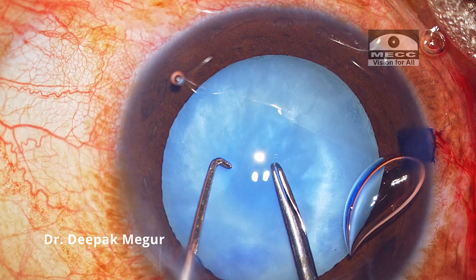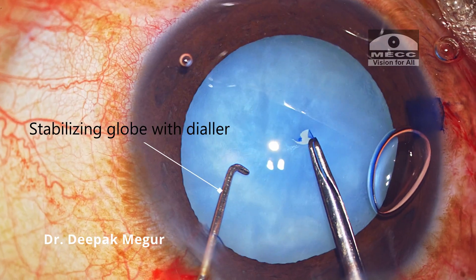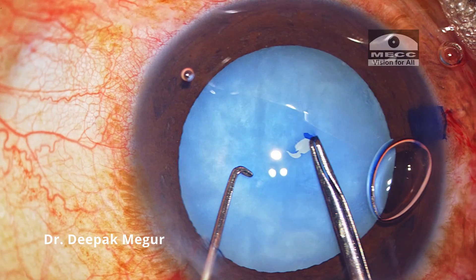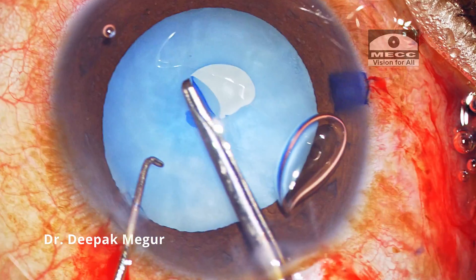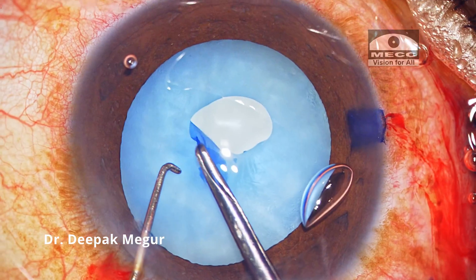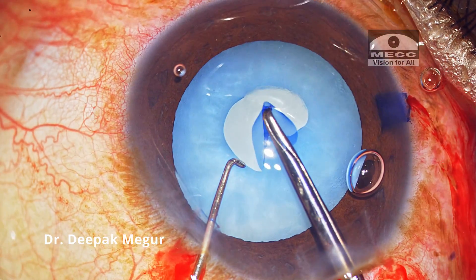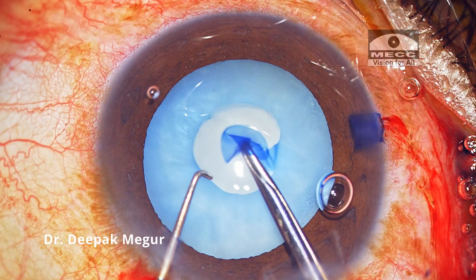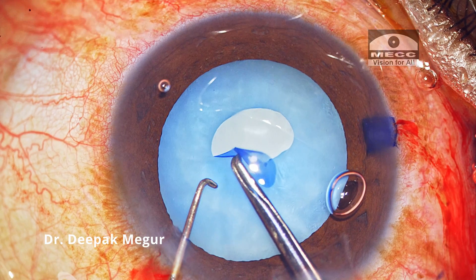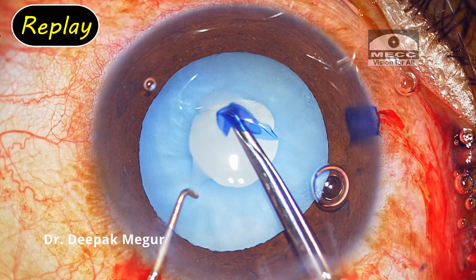Under the cover of dispersive OVD, I begin my rhexis. I use a second instrument to stabilize the globe and also control its movement, and I always prefer forceps for performing rhexis in such eyes. My aim is to create a small 3 mm rhexis. I'm predominantly using the tearing technique while performing the rhexis, avoiding complete folding of the capsule which we typically do. I'm keeping a very close watch on the edge and trying to tear it in a controlled manner with the direction of the pull being centripetal.